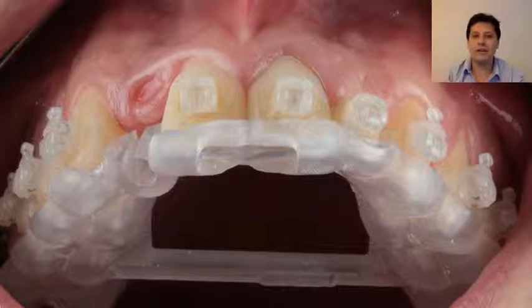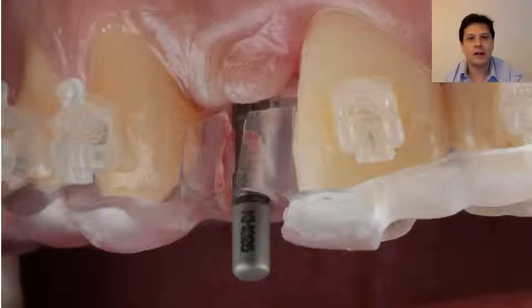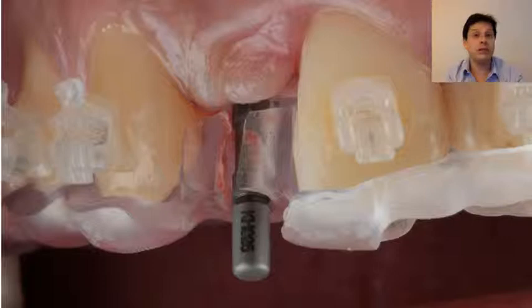So this is a perfect example, and for me one of the best examples of how digital dentistry came to change our daily lives. And look at the picture. This is the final drill already in place. Did I open a big flap? No, that's perfect for patients. That's perfect for teeth and the surrounding bone. You avoid recessions and other problems.